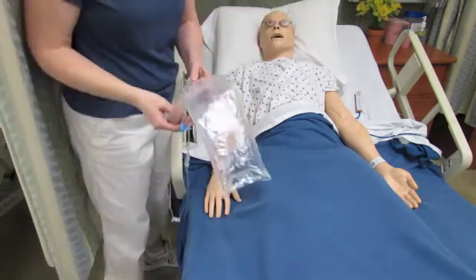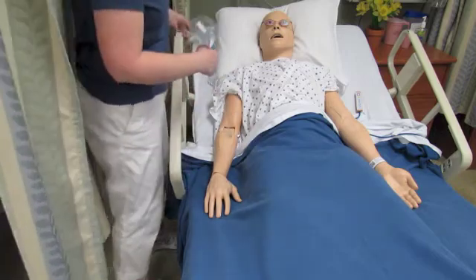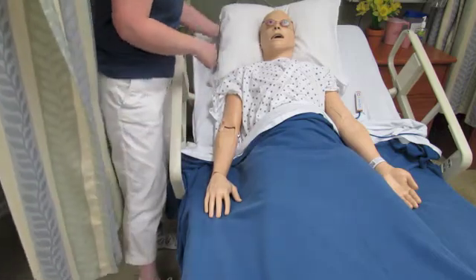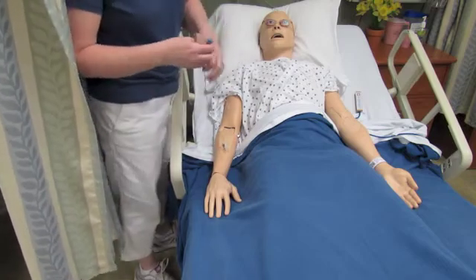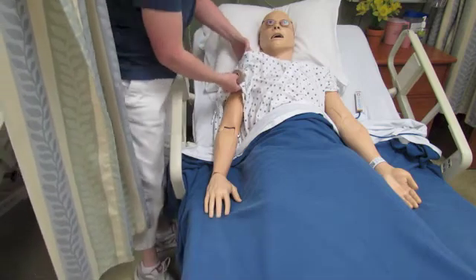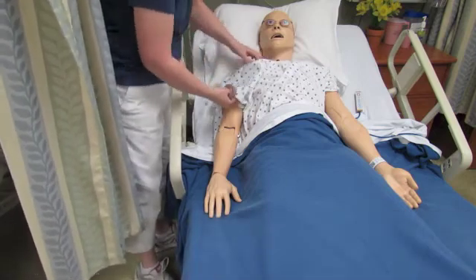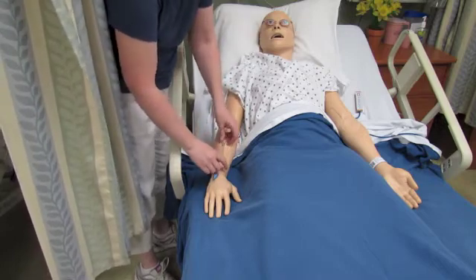Typically I like to store the IV drainage bag underneath the patient's pillow so that it's out of sight, but make sure that it's not totally out of mind, because after 1,000 milliliters it gets kind of full. And I do kind of run the tubing underneath their gown so that it's kind of out of the way.